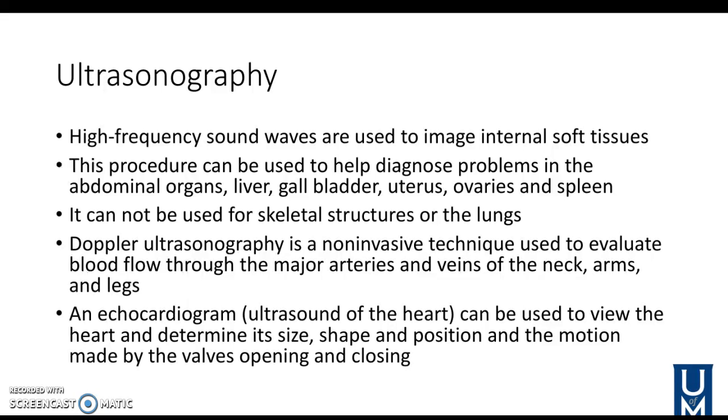So I'm sure a lot of you have heard of ultrasound before and think about when babies are in the womb. They often get ultrasounds to make sure the baby is developing properly, but ultrasounds can be used for lots of other things. So if a patient is suspected to have gallstones, they may have an ultrasound ordered. Again, with the echocardiogram, they may get that ultrasound of the heart, or just that Doppler ultrasound to view the blood flow in their arteries or veins.